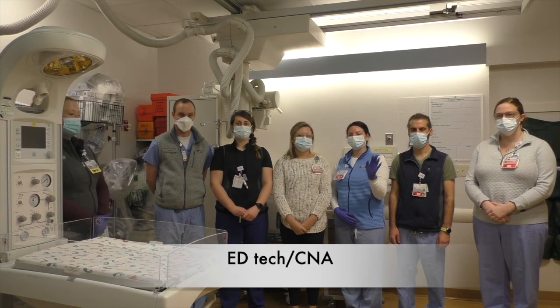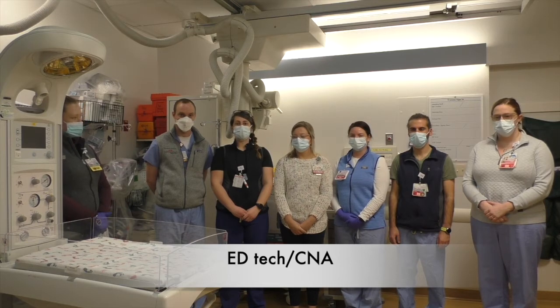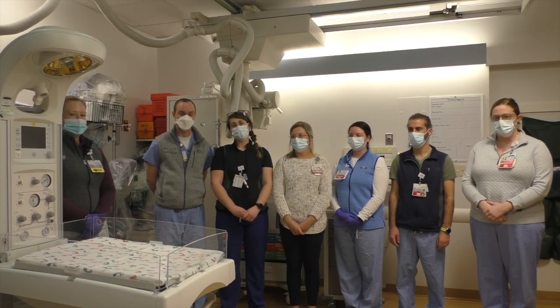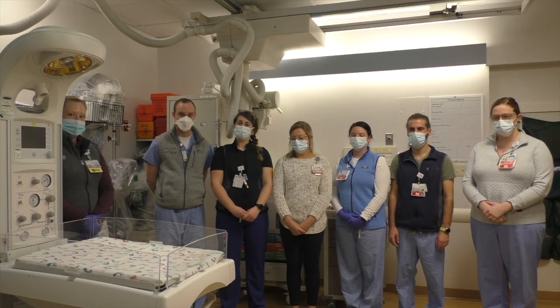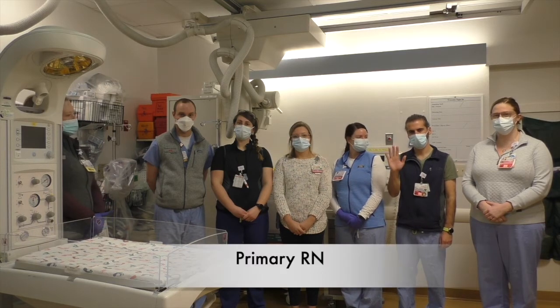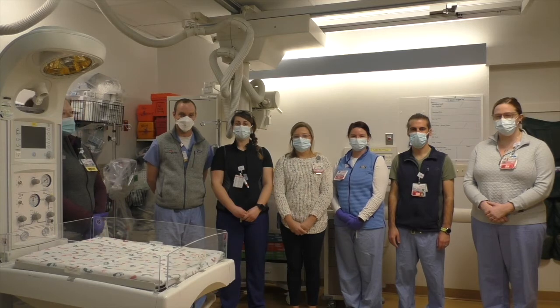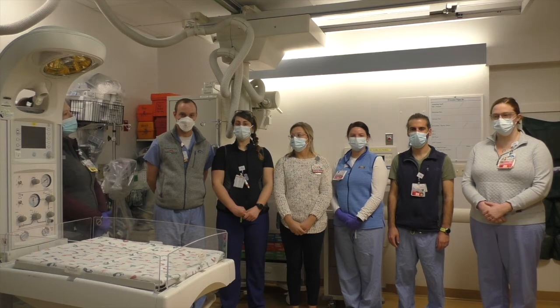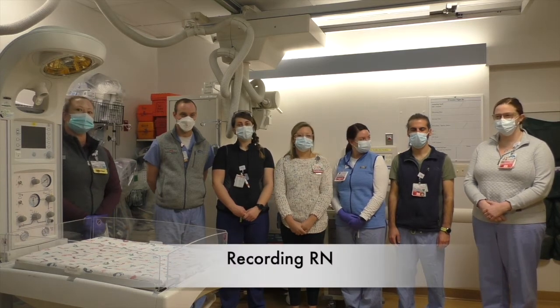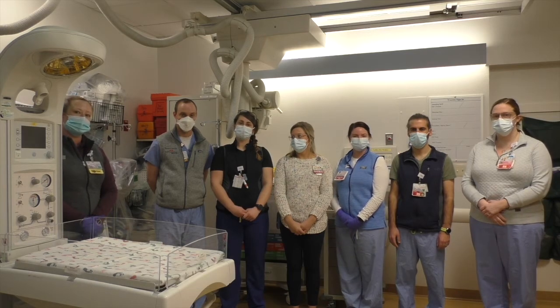Mackenzie is our tech. In addition to assisting to dry and stimulate the baby, after that's done, she's going to help us clear away the wet linens and then get the baby on the monitor with the goal to get the pulse ox on the right upper extremity and apply a 3-lead ECG monitor. Charlie is going to be our primary nurse who's going to work on establishing IV access when the baby arrives. Additionally, he will be the one administering any medications that we might need. And then this is Mackenzie, who is one of our other nurses, who is going to be our recorder and keep us on track in terms of time for our resuscitation algorithm and APGAR scores.